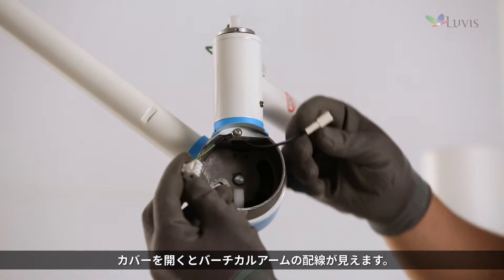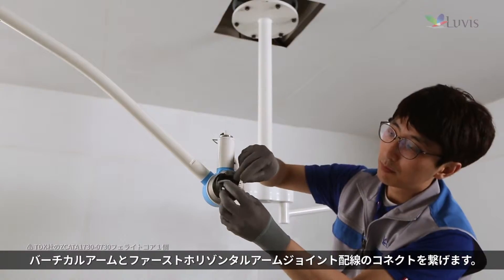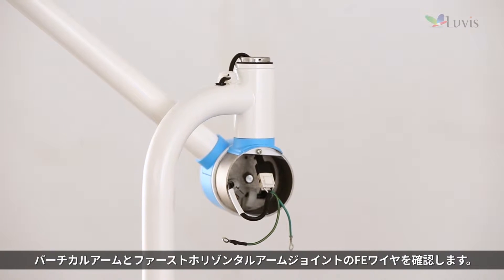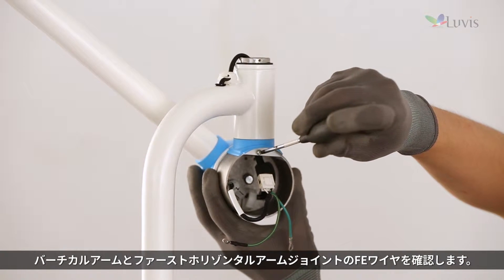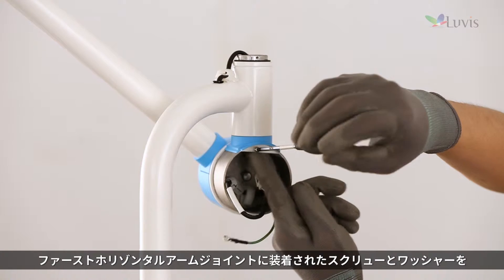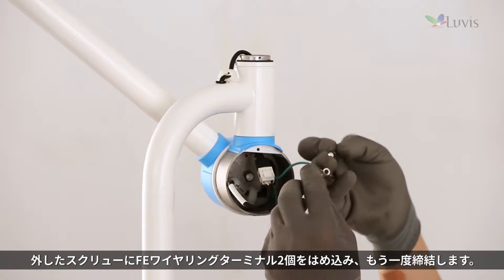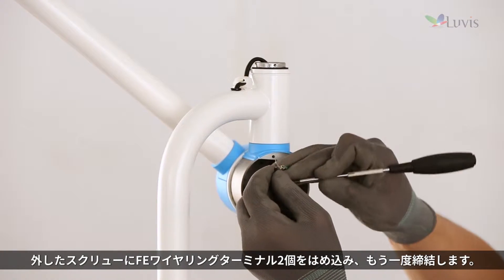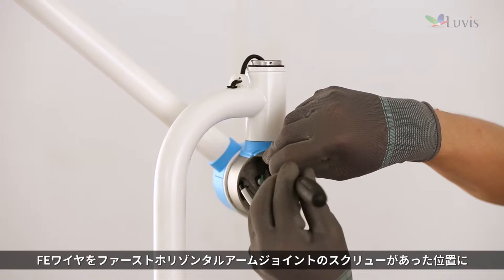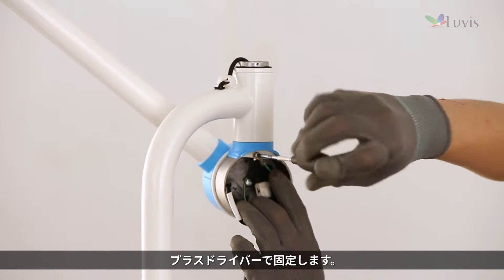With the cover open, you can see the vertical arm's wiring. Connect the wiring between the vertical arm and the first horizontal arm joint. Check the FE wire at the joint. Completely release the screw and washer mounted to the first horizontal arm joint using the plus driver, then put the release screw through the two FE wire ring terminals and tighten it again.